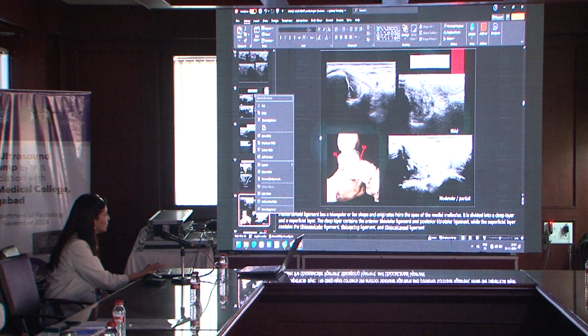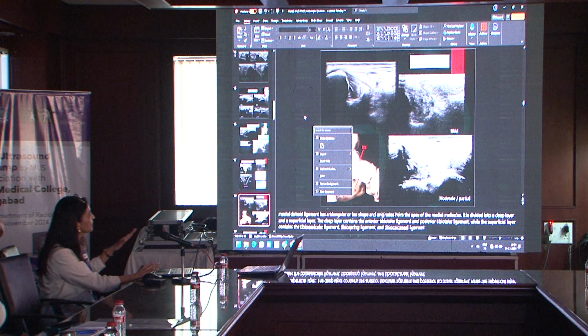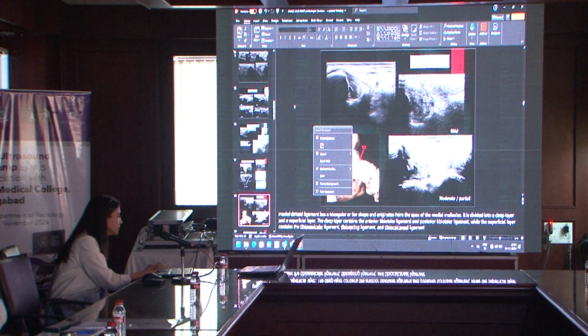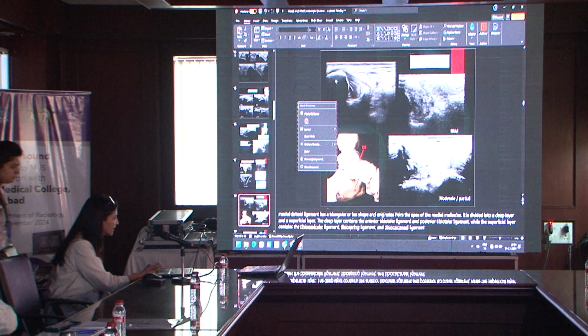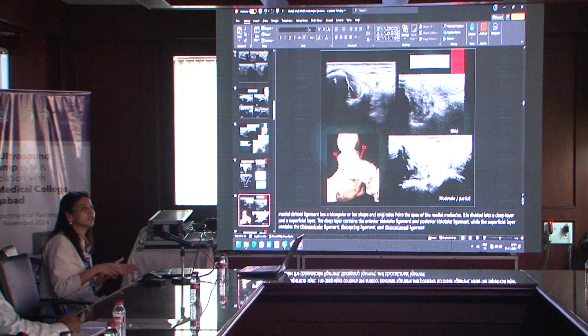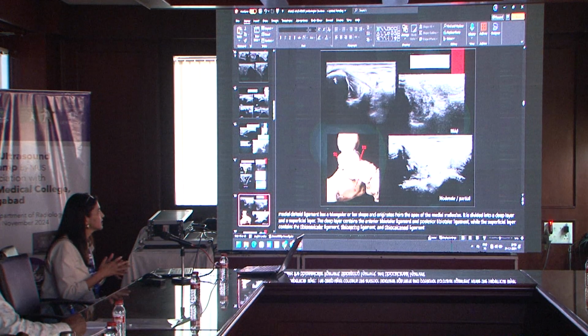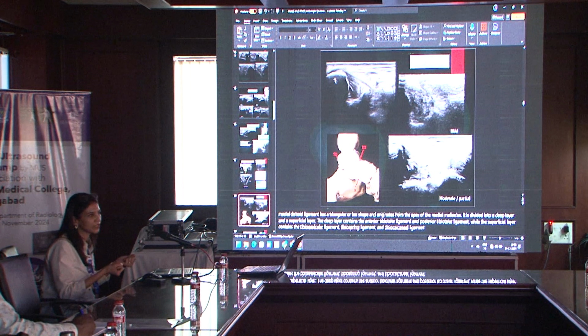Okay, coming to now the medial compartment. So, we are done with the lateral compartment. Some of the examples of the medial compartment injury is deltoid ligament. So, deltoid ligament, again, it does not really injure in isolation. There will always be some other injuries, either a lateral compartment injury, because it is a very strong ligament.